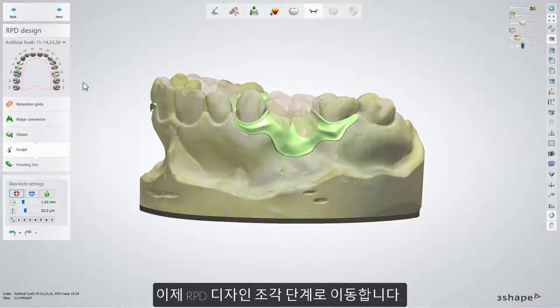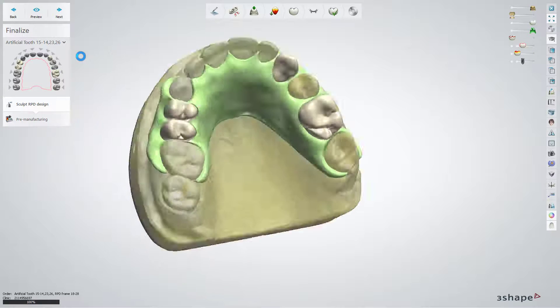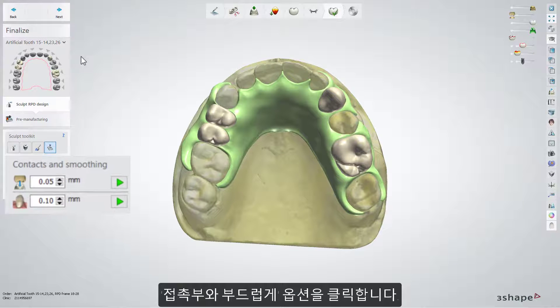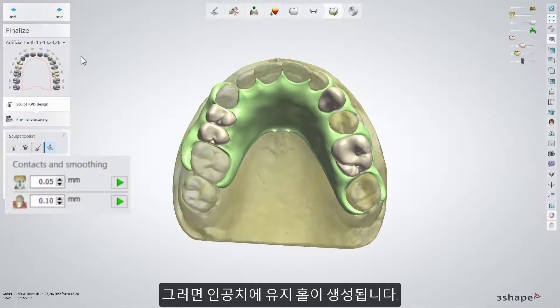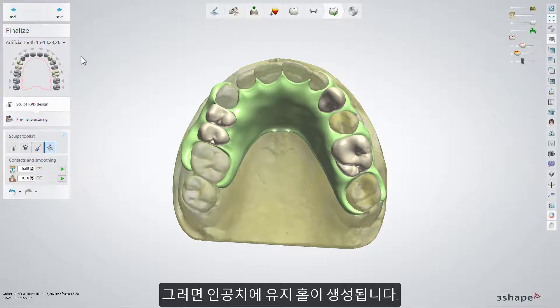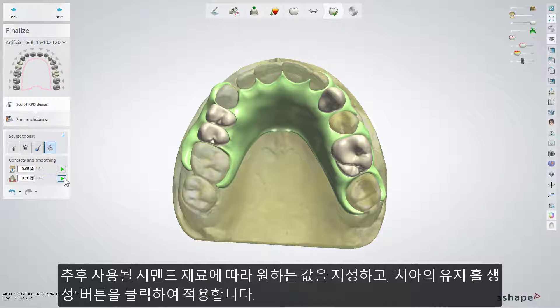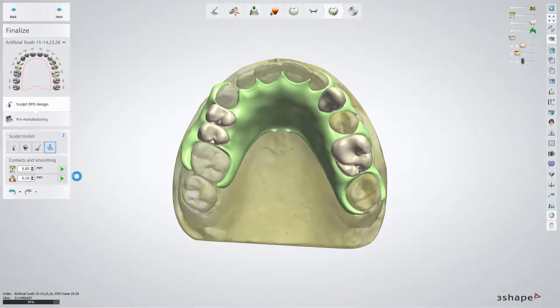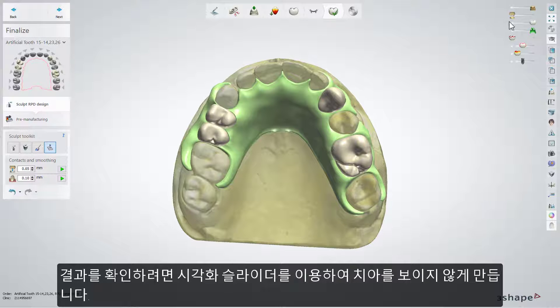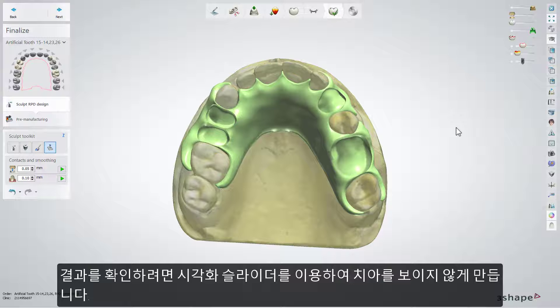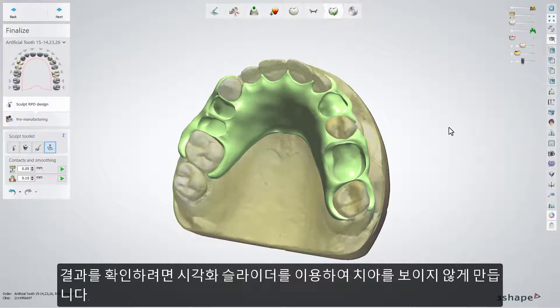Now you can move to the sculpt RPD design sub-step. Click on the contacts and smoothing option. This option will create the pockets for the artificial teeth. Set the desired value, depending on the cementation material which will be used later, and press the create pockets for teeth button to apply it. To check the results, make the teeth less visible with the help of the visualization slider.